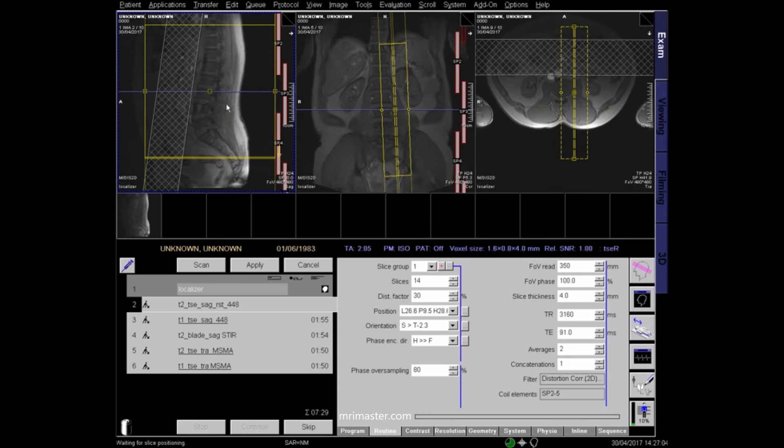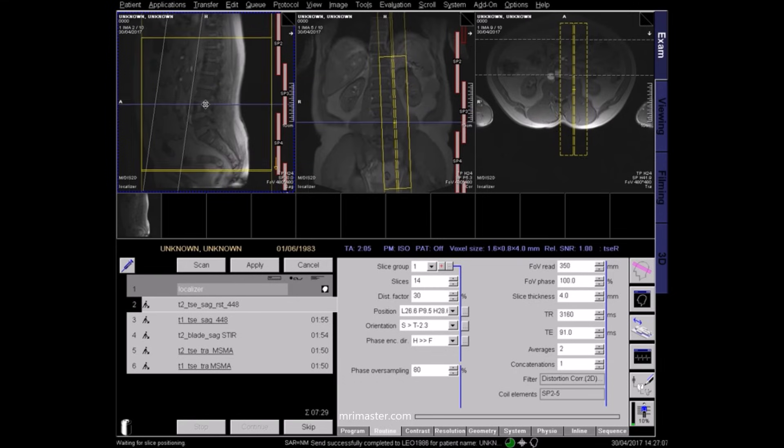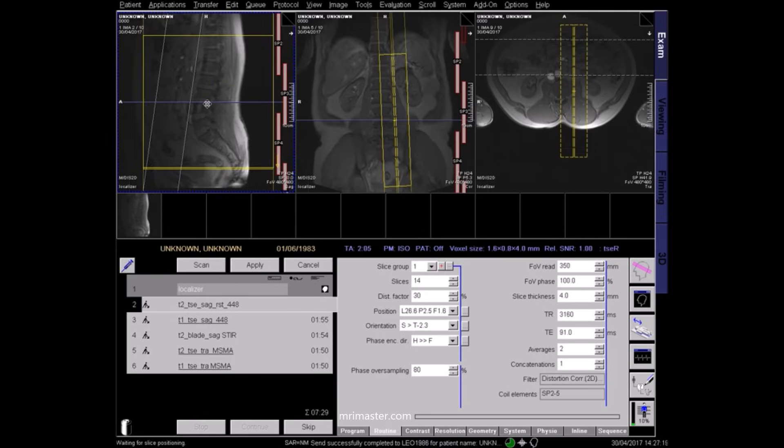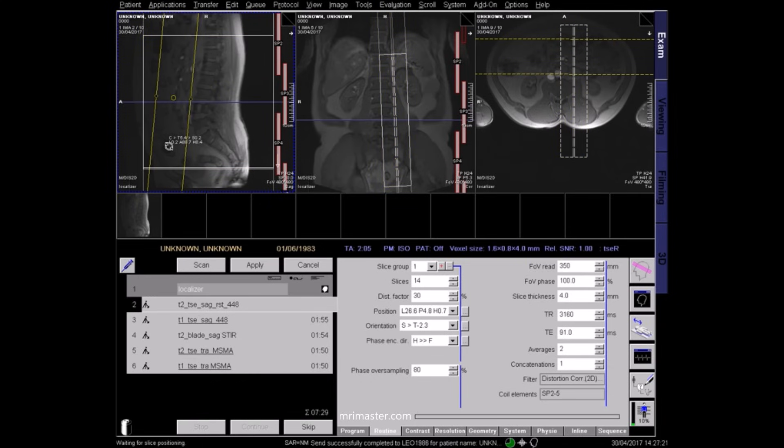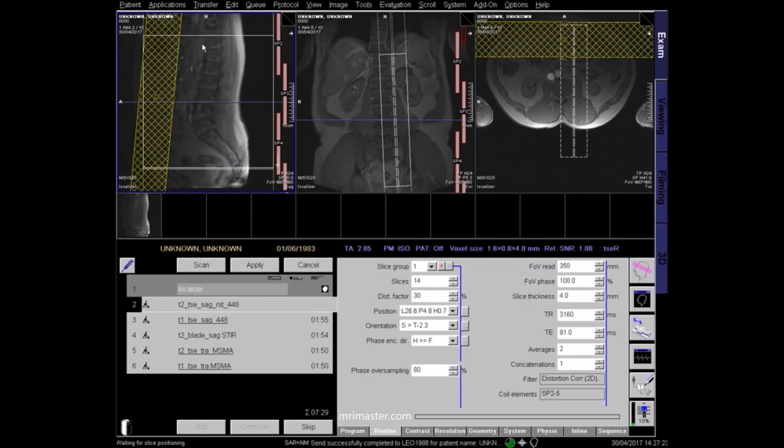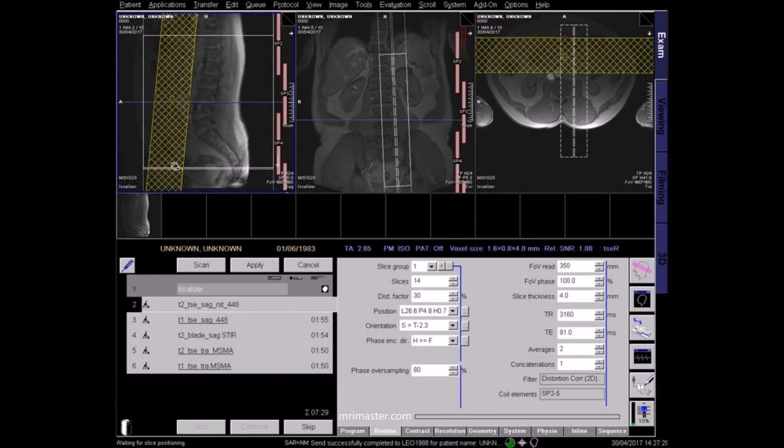Now plan your first sagittal sequence. On the sagittal localizer, the field of view should cover the sacrum inferiorly and T12 superiorly. Bring the saturation band close to the vertebra to eliminate artifact from respiration and pulsation of the abdominal vessels.